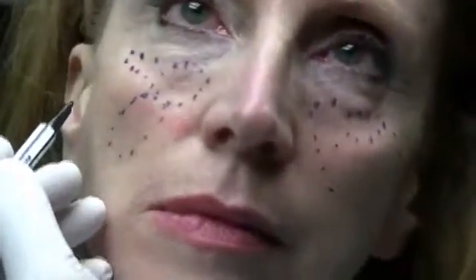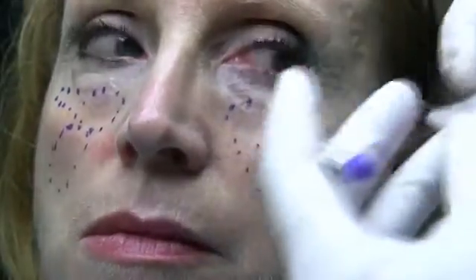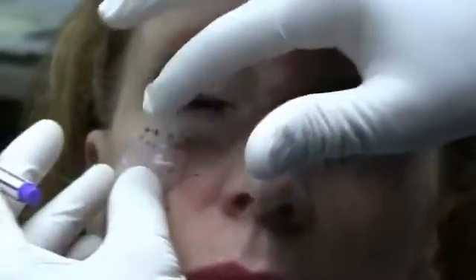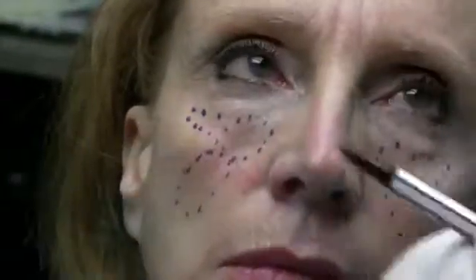I published an article in Dermatologic Surgery several years ago, "Give Me a Face Implant," about using a cheek implant as a template for filler. This is a good area to illustrate this, where you can actually take an implant and trace it out on the face, and that gives you almost a perfect template of where to put that filler.